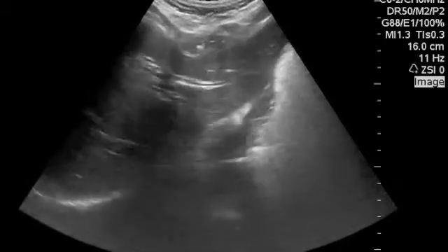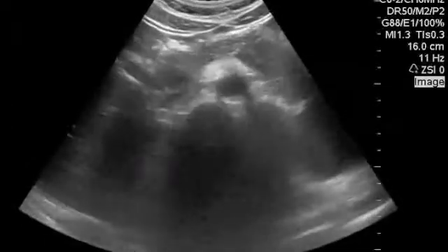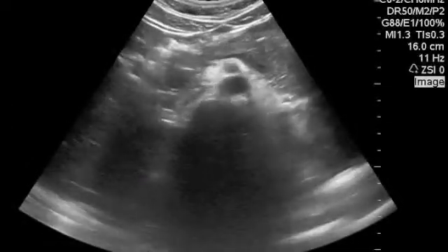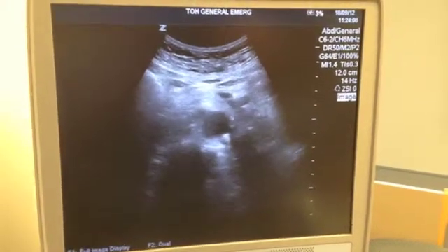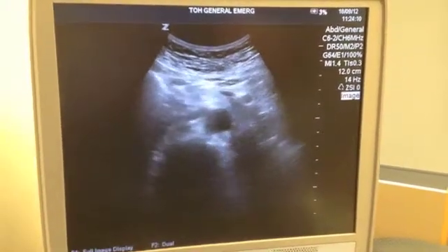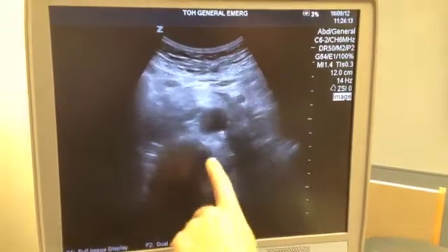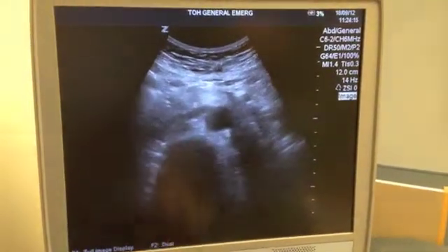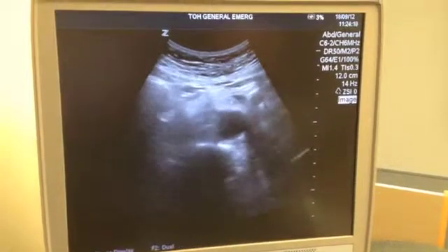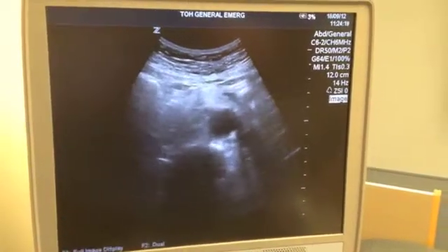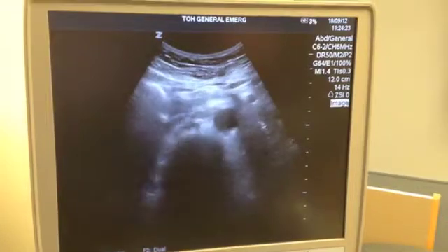Here you see the probe at an angle, and as I bring it up to perpendicular, the aorta will come into view. Once the probe's on the belly, you'll want to try to identify the vertebral body. That's a white echogenic line with a shadow behind it. The aorta is a round vessel directly in front of the vertebral body.